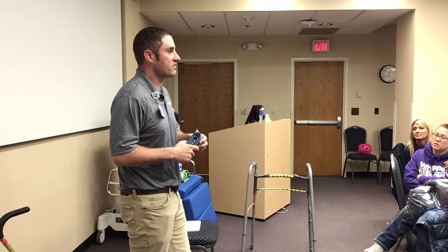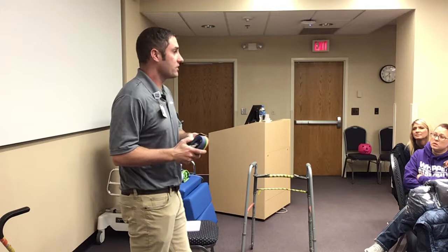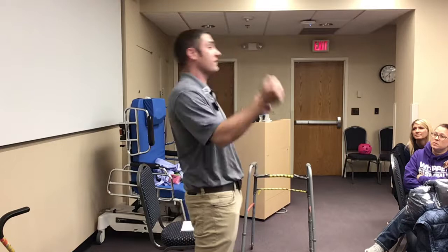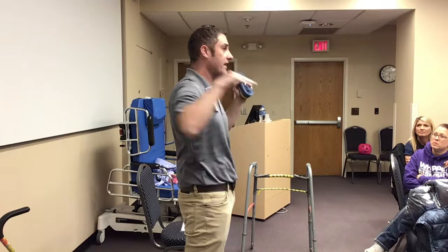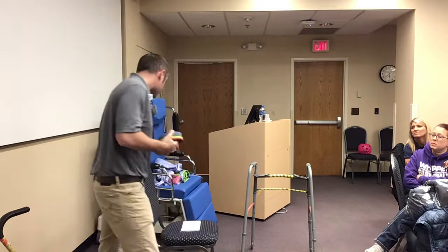When using the gait belt, let the patient initiate it — let them be the ones to stand before you start pulling on them. Because if you start pulling before they're ready, a patient's first inclination is to resist you. If you bring their hips forward, they're going to slam their shoulders back. If they're sitting on the edge of the bed, now their hips are forward, shoulders are back, and they're sliding off the edge of the bed. So give them time and let them initiate the transfer as much as they can — a lot of times they'll surprise you how well they can do.